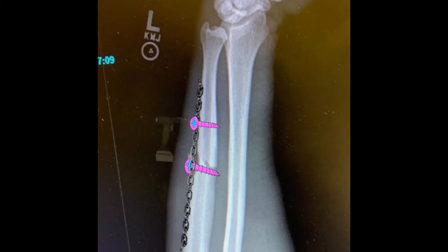After the plate is applied and we know it's long enough — with three screws on the proximal and distal ends of the fracture — we can drill and fill our remaining screws: at least three above and three below the fracture. The reason we want three screws both above and below is that it creates a strong enough construct to help control both bending and rotation of the bone.